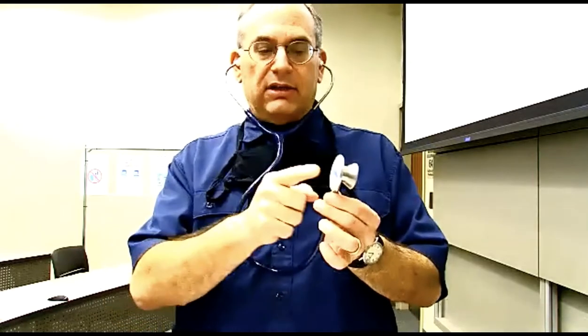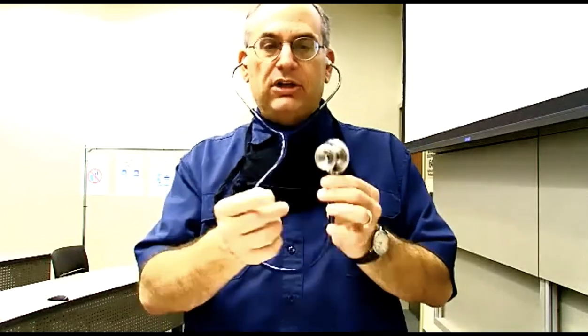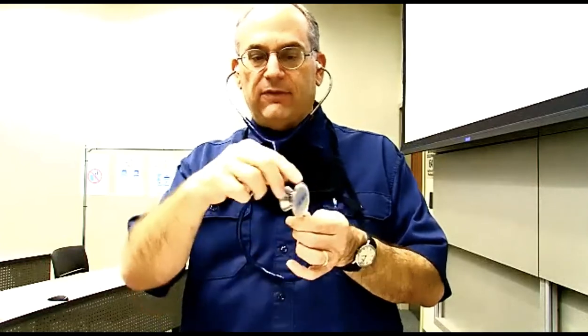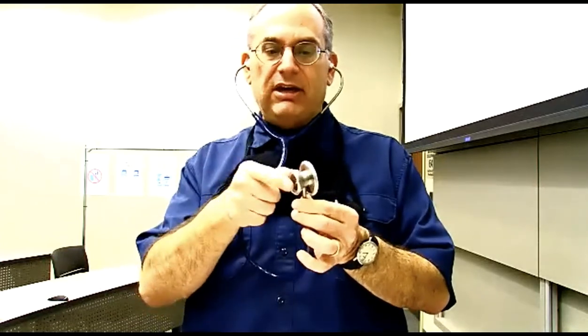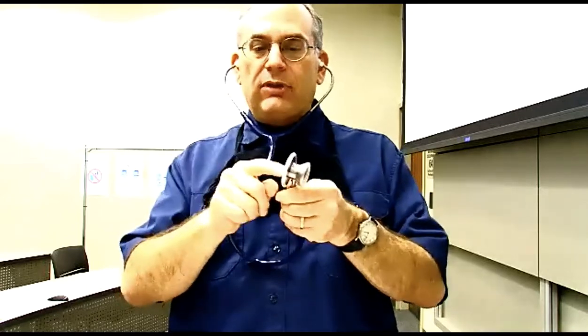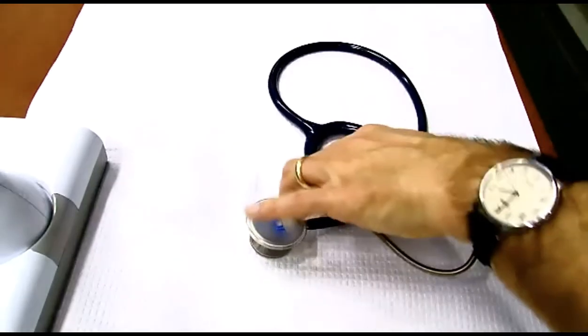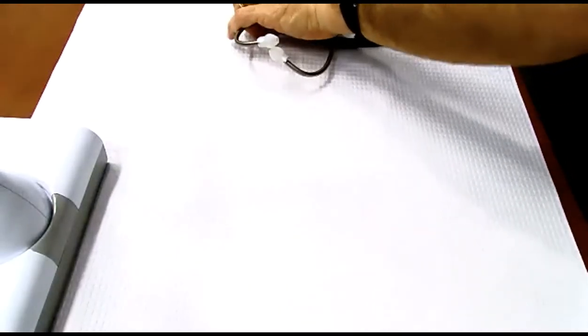With this in your ear, very lightly, and I'm going to have you practice here in a little bit, right now actually, very, trust me, lightly, tap. With it in your ear, tap very lightly on the diaphragm, and see if you can hear it. Turn it to the bell, even, and then do a little tap and see if you can hear it from the bell. So I'll give you a second here. Try to put them in your ear and see if you can hear sound from both sides by lining up the dot with whatever side you want to have active, okay? Trust me to do it lightly. If you do that little sound check, then when you go to take the blood pressure, you'll know that at least your stethoscope is set right and you should be able to hear correctly. I'll give you a second to play around with that. Do it lightly, trust me, especially with the diaphragm.